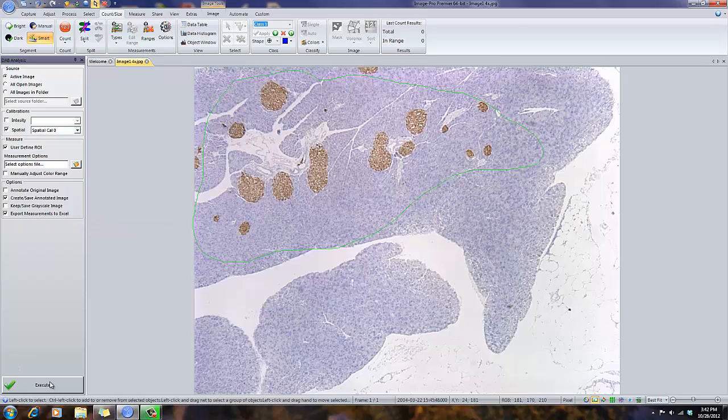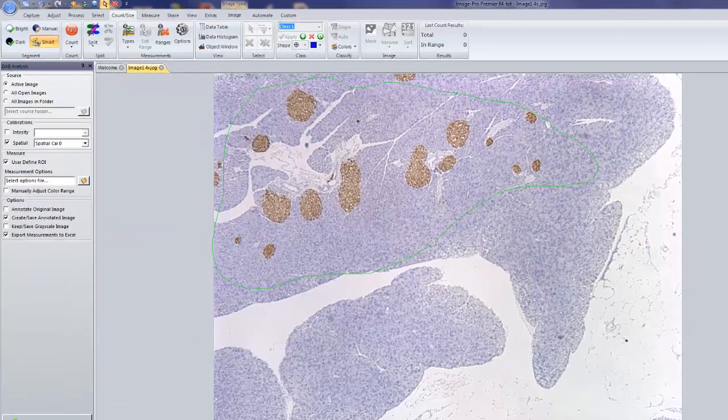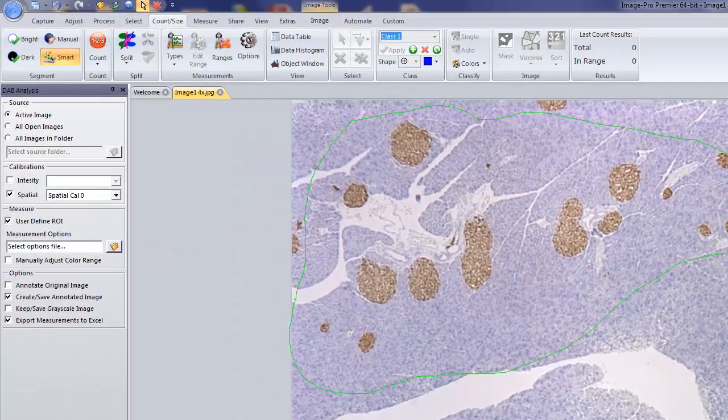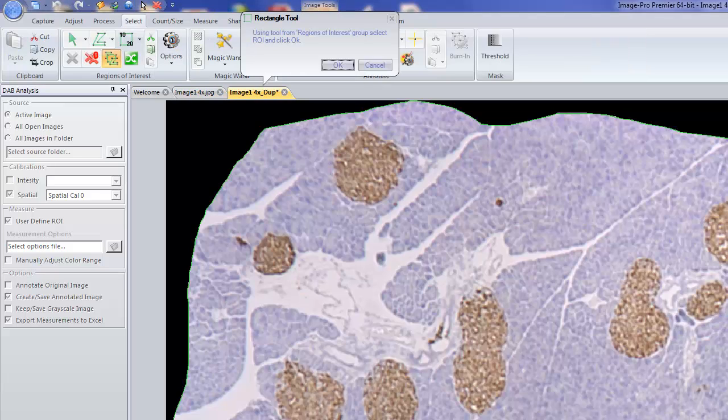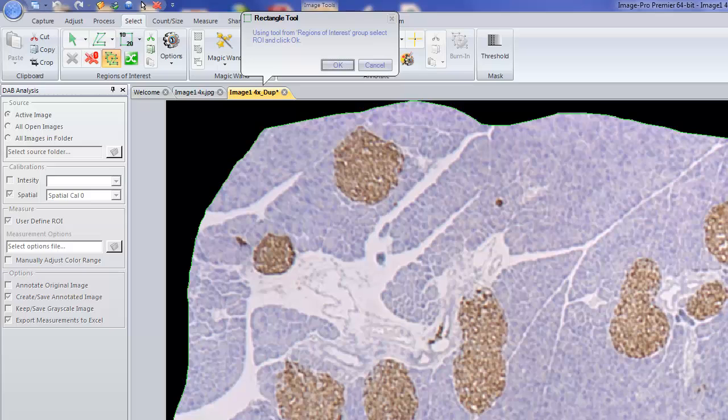We simply press the Execute button. And since I've already defined the region of interest, it's automatically taken that into account. So I just predefined it a little ahead of time.